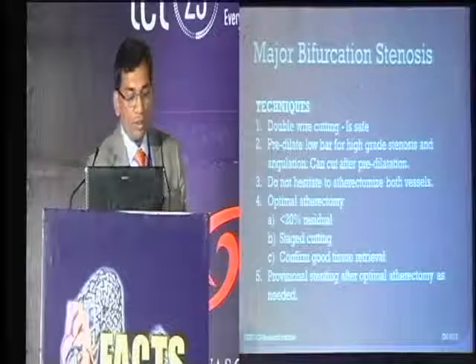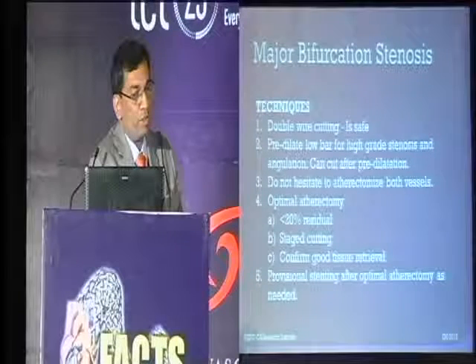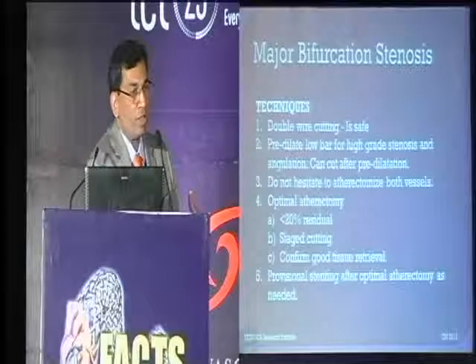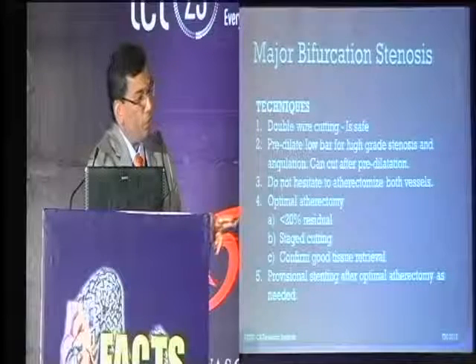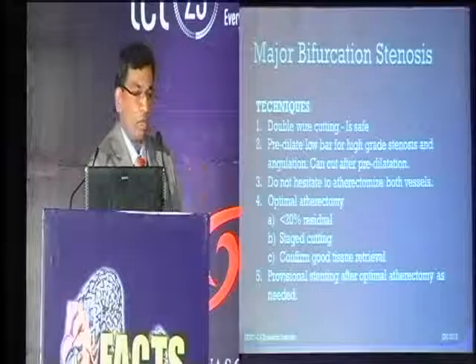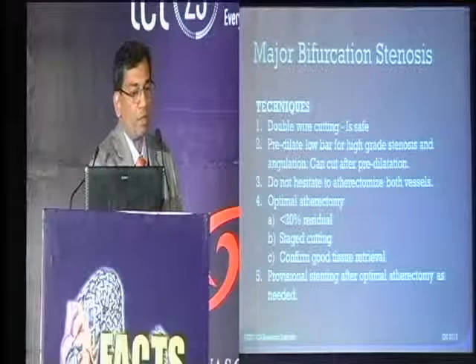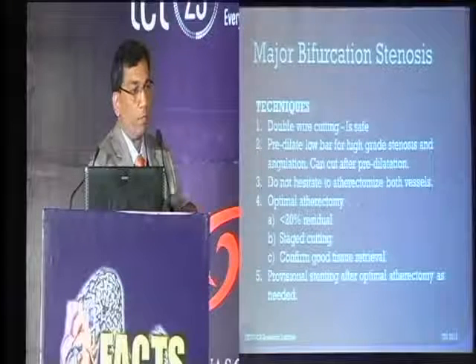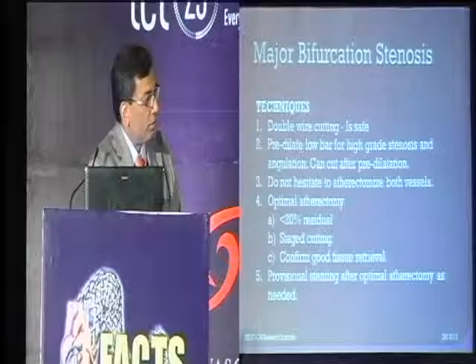There are a lot of myths and beliefs in using atherectomy, especially in bifurcation stenosis. People are nervous about using atherectomy, whether it's directional or rotational. If you have a second wire in place, I've had a lot of experience with this. It's pretty safe, it can be done with a few tricks. You may have to pre-dilate an angulated lesion or a very tight lesion before you use the atherectomy, so you minimize cutting the wire or difficulty in delivery of the atherectomy device.